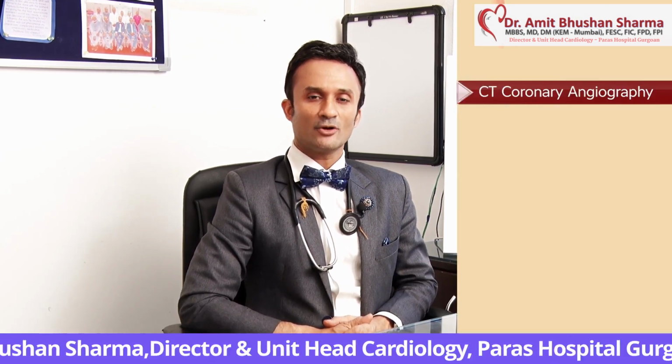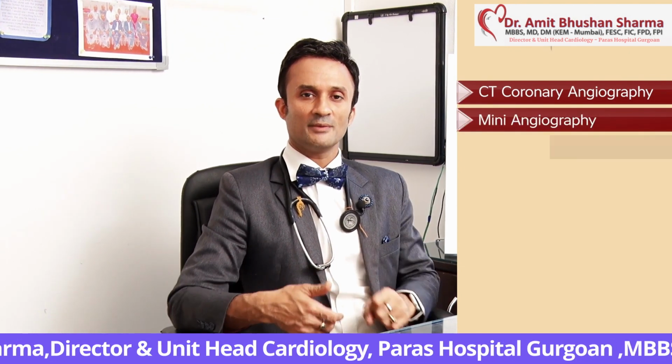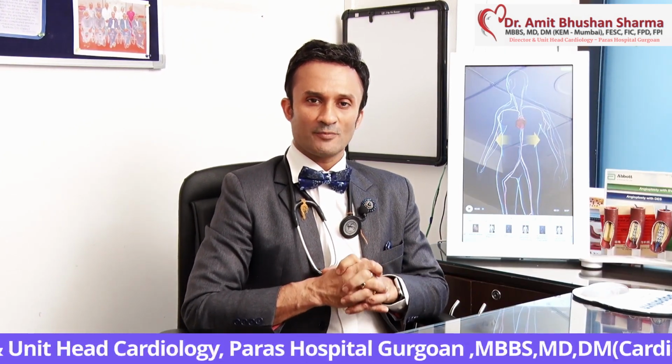Angiographies, there are three types of angiographies: a CT coronary angiography, a mini angiography which is done through the wrist, and a major angiography which is done through the groin. What indication is for which type of patient?